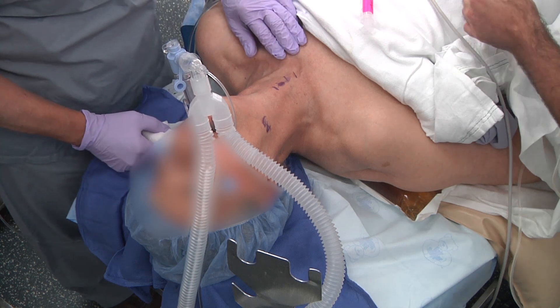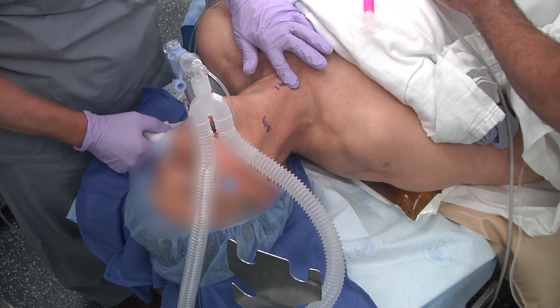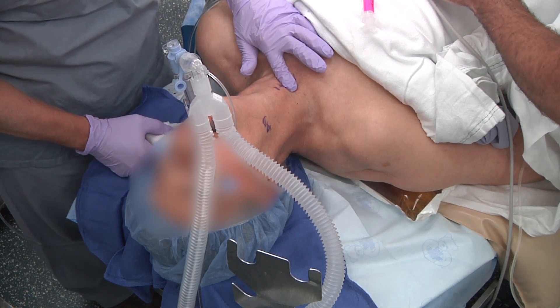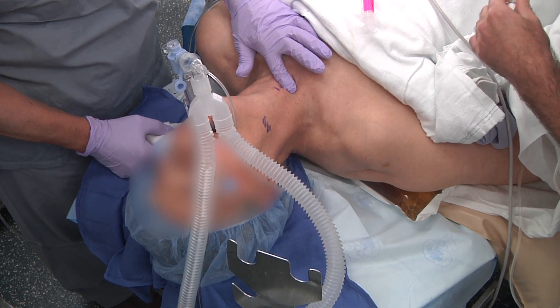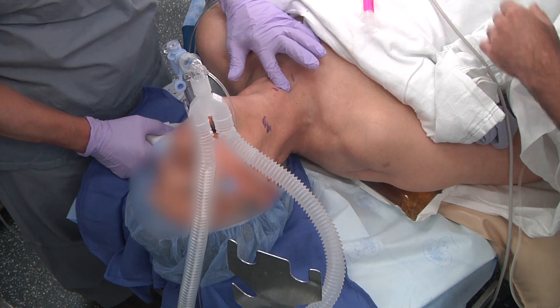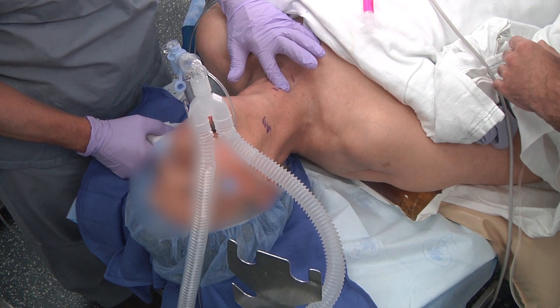During marking of the neck, the surgical team notices a prominent and very high-riding innominate artery.